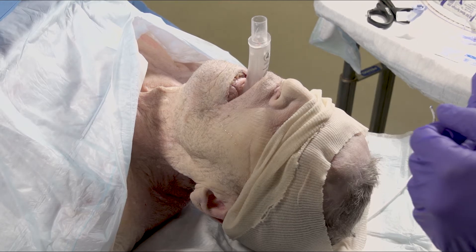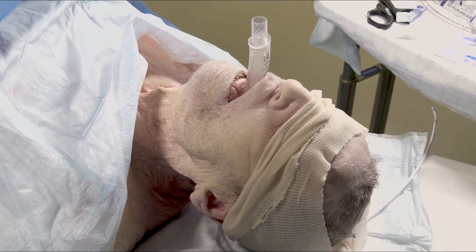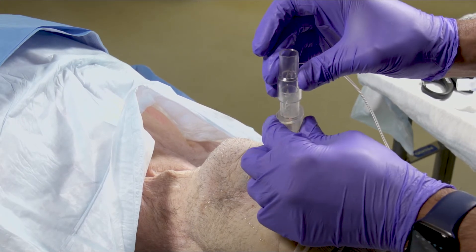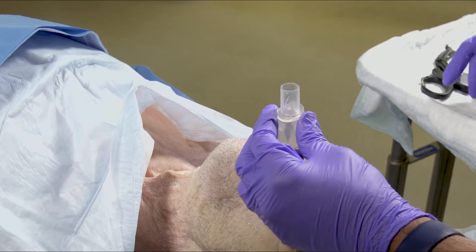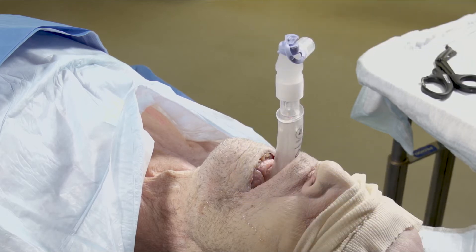If you have an iGel in place and you've decided to intubate through it, have your disposable fiber optic scope set up but do not load an endotracheal tube. Make sure you've got good gas exchange via the iGel with capnographic end tidal CO2. Once you've confirmed that, remove the end tidal CO2 adapter and connect a bronch adapter. Then connect the patient to the vent or have an assistant bag with a manual resuscitator.